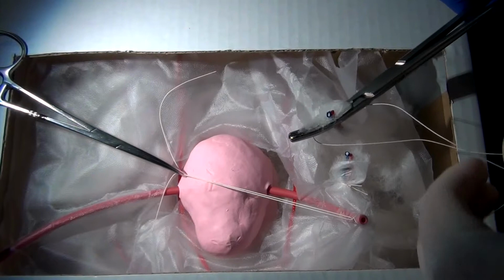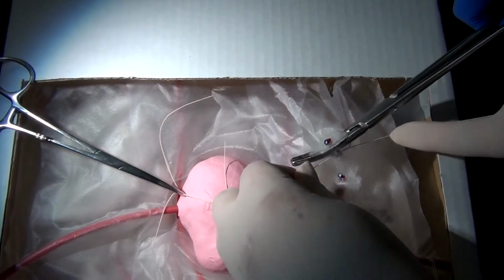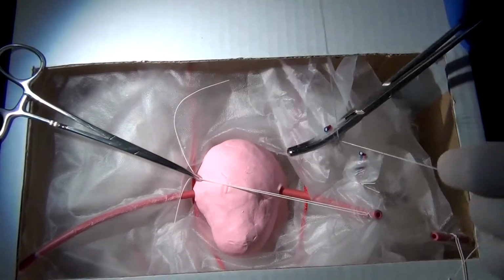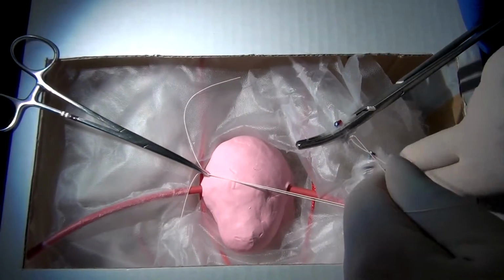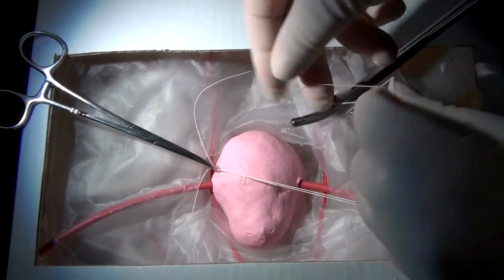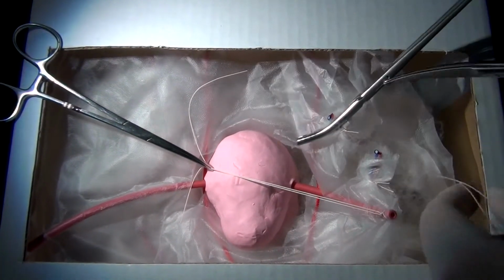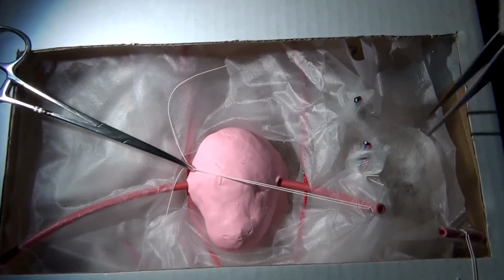And this is the simplicity of getting into the retroperitoneal space. So again, the key point of this dissection, flash for me, is if you go in as distal to the round ligament as possible, you'll be closer to the lateral sidewall. That allows you to enter what we consider to be the paravesical space. We know that deeper down we can get into the pararectal spaces, but for the sake of this simulation, we're focusing on the paravesical space. Go ahead and take that off. So here is our infundibulopelvic ligament.